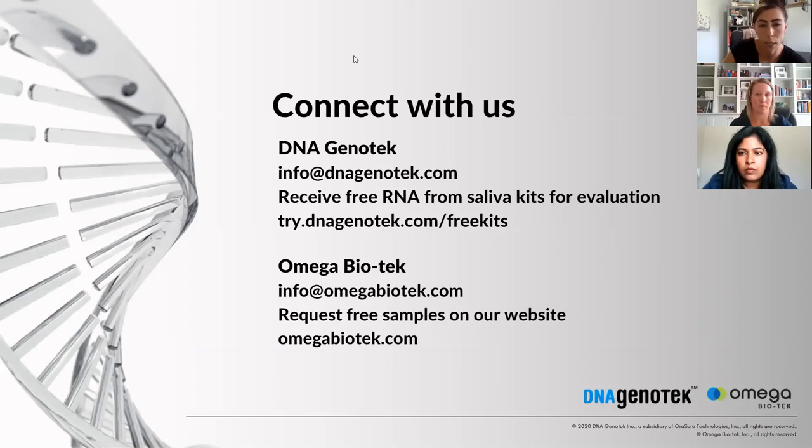Okay. And then what is the low detection limit for SARS-CoV-2 RNA from saliva samples? So I think, as Kiran showed, and I also mentioned in my part of the webinar, it depends on the assay what the detection limit is for the SARS-CoV-2 virus. Kiran gave a really nice overview of the different limits of detection for saliva and nasopharyngeal swabs, and it really is assay dependent. But I think the key takeaway is that in those assays that are comparing saliva to nasopharyngeal swabs, there's a lot of studies showing similar sensitivities for both sample types.